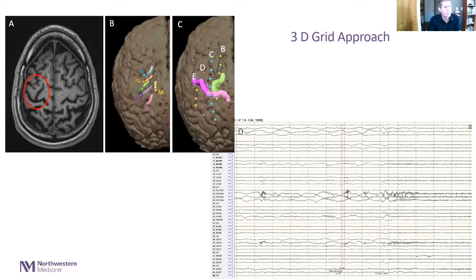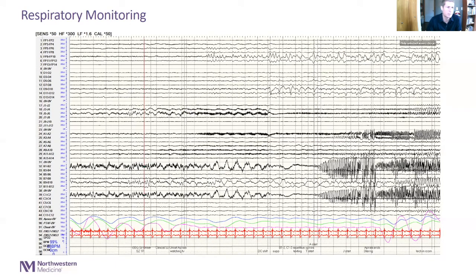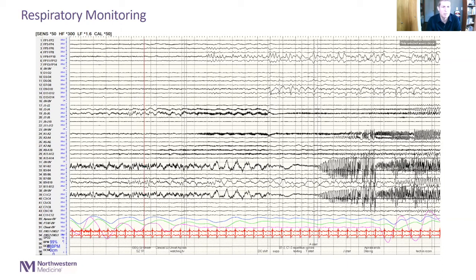We do respiratory monitoring in our center with our invasive electrodes, and I think that is extremely important. A large number of patients — as you can see here — show apnea as the very first clinical sign before anything is objectively visible at the bedside. This is often easier to detect than ictal tachycardia, which is probably more common but often a gradual process. You can really see that after about 10 seconds in this 30-second page, the patient has an abrupt cessation of airflow. That corresponds with amygdala involvement at electrodes A and J, and the temporal tip, and then subsequently the involvement of the hippocampus — showing the correlation between clinical onset, EEG onset, and ensuring you see something on EEG before seeing it clinically.